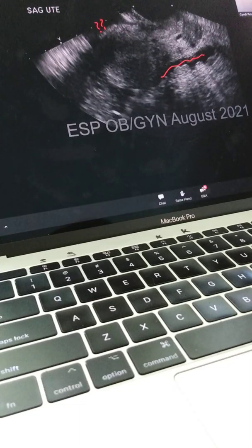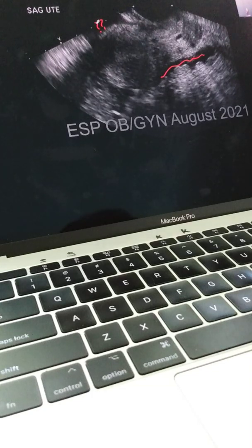Good. So we know where the bladder is by location, right? And it's in the upper left-hand corner of the image. Now, you could have fluid collect there as well. And so if you're scanning, you may see the bladder separate. Good, very good. I'm going to have a harder question for you guys.